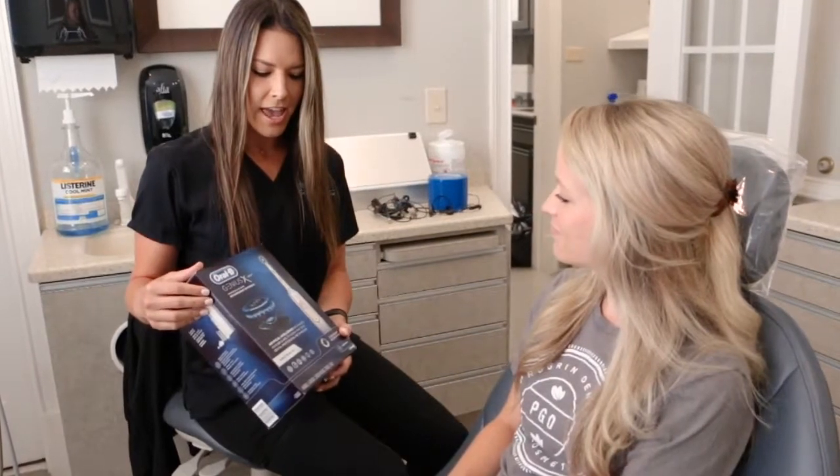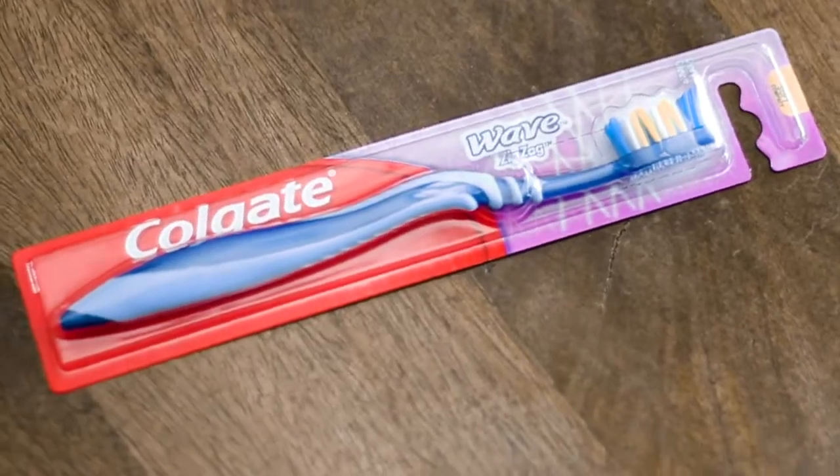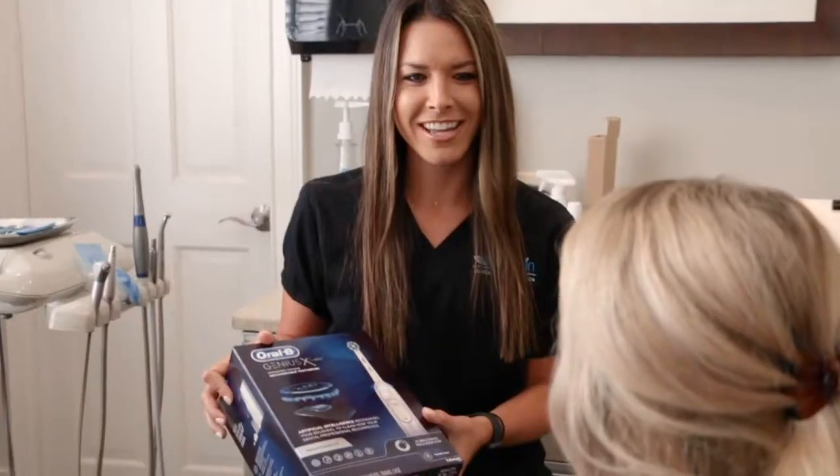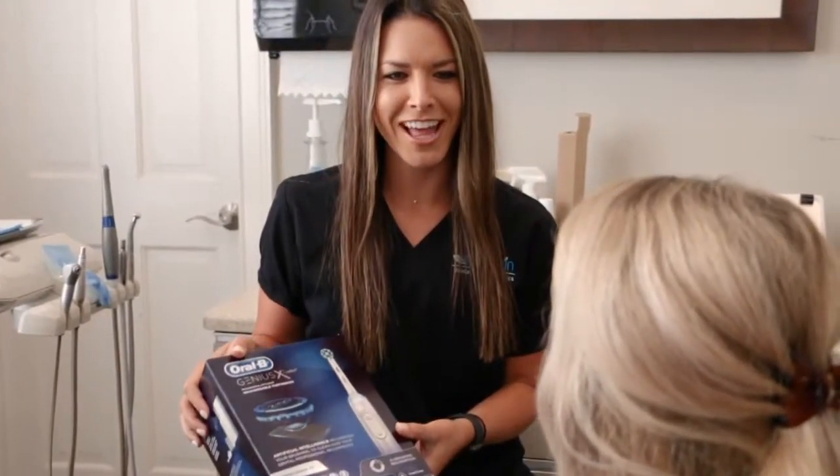My name is Maria and I'm a dental hygienist at Program Dental of Greenville. I get asked almost on a daily basis if my patients should be using a manual or electric toothbrush. I always tell them that the best thing they could use for their teeth is an electric toothbrush.